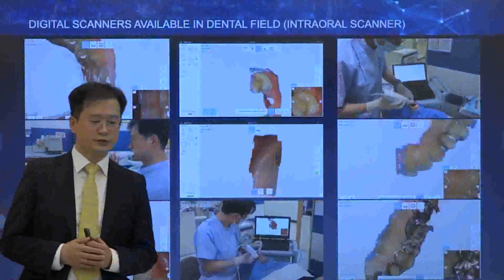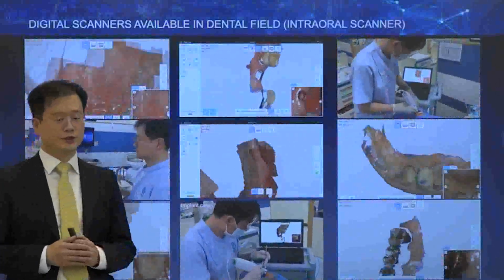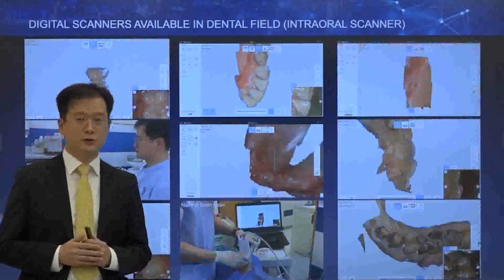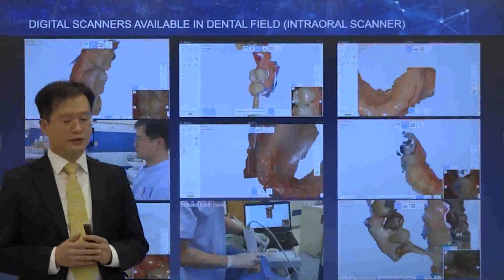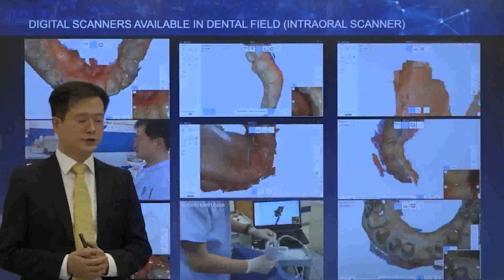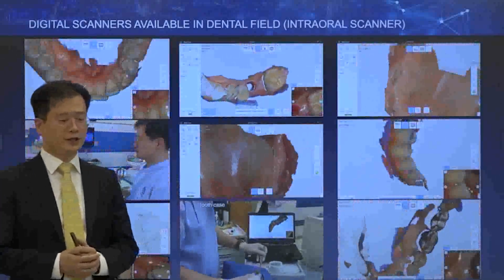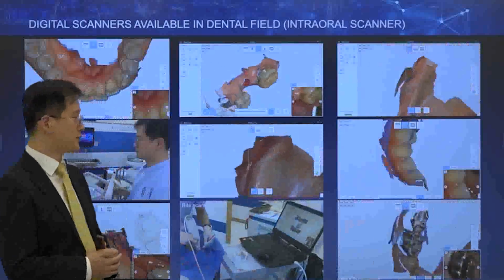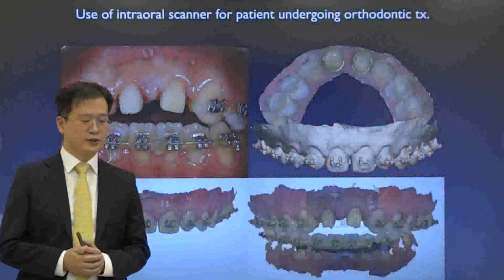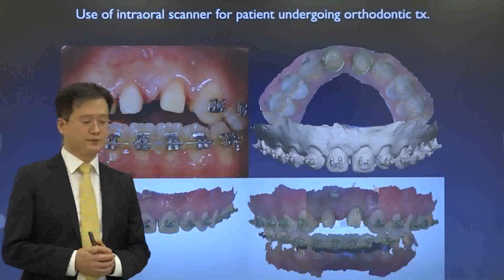Ten years ago, the intraoral scanner was big and heavy. Because the data were completed by image stitching, I had to hold my breath and push the pedal cautiously to avoid shaking the image. There were many data distortions. However, recently introduced scanners are small and lightweight. It is easy, fast, and accurate enough to scan even the soft tissue. Even if brackets are attached to the teeth, we can make a digital impression of the patient without discomfort.